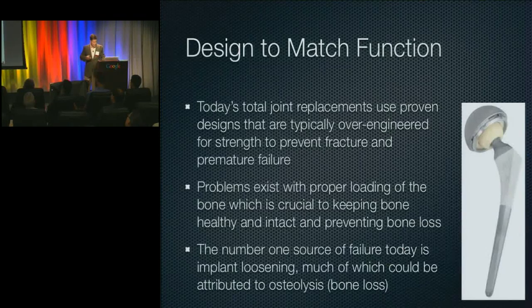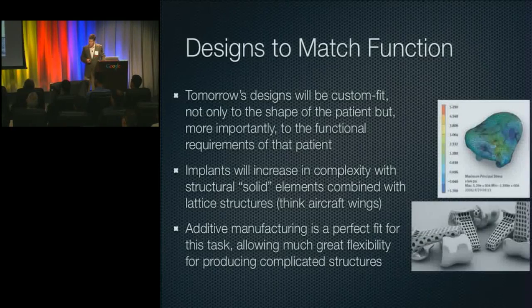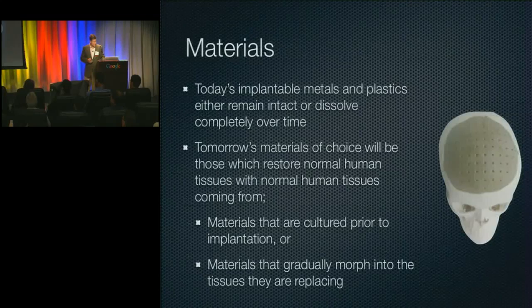And then I think where it goes from there is design matching functions. I talk a little bit about this in the paper, so I won't go through it here, but really to take what today is over-engineered and define it, make it more personally engineered to that patient for structural purposes. And the same thing for functional elements, to really make those fit to you. This is an example from a company in the UK called Within. It's a very interesting company, taking finite element information and putting that into the design and making it way complex, and based on that, being able to push forward and do some things that haven't been done.